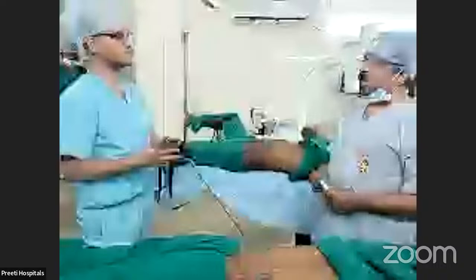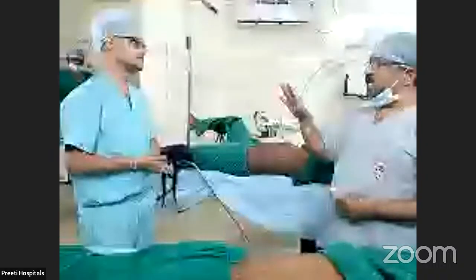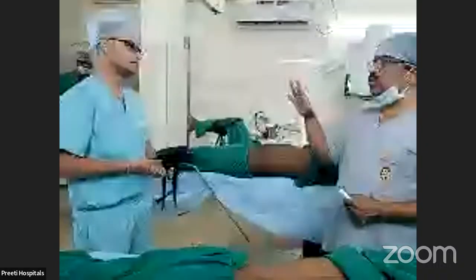In prone, you will directly go and attack the posterior calyx. To attack the anterior calyx is very difficult. Ideally, going vertically down to reach the anterior calyx, you have to cross the calyx. Yes, it is a cross-calyceal puncture. Bleeding will be more, or else you have to go laterally.